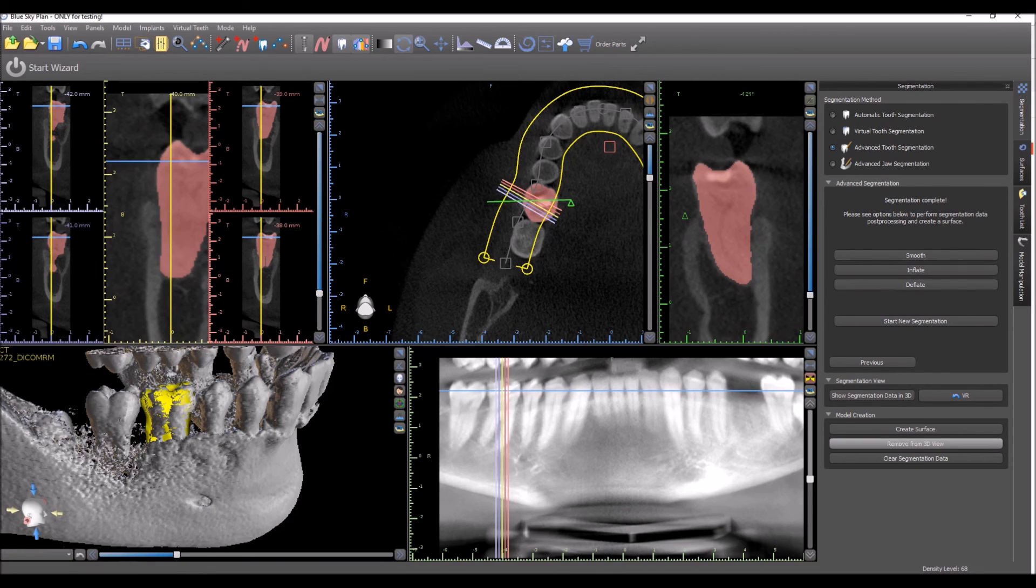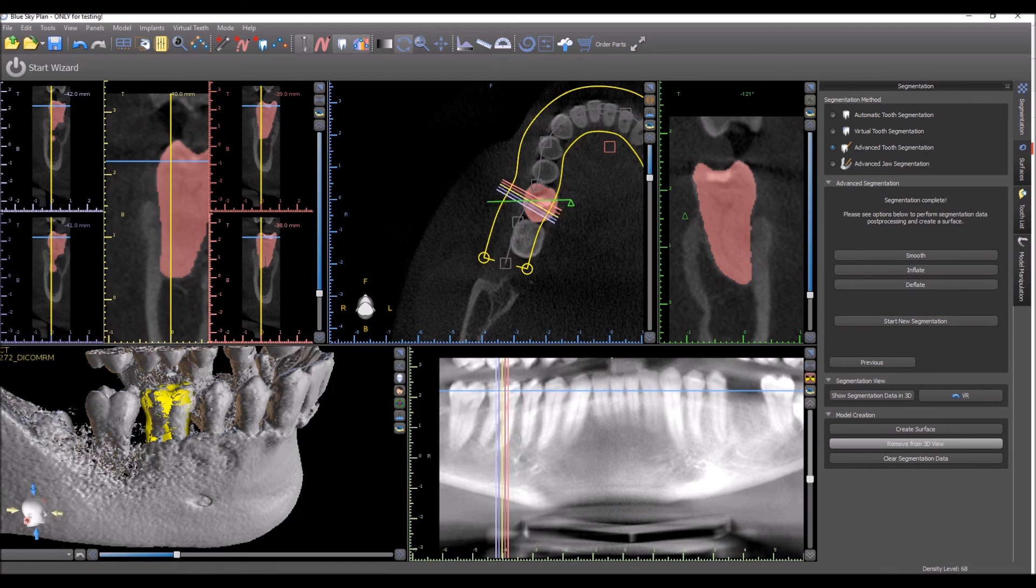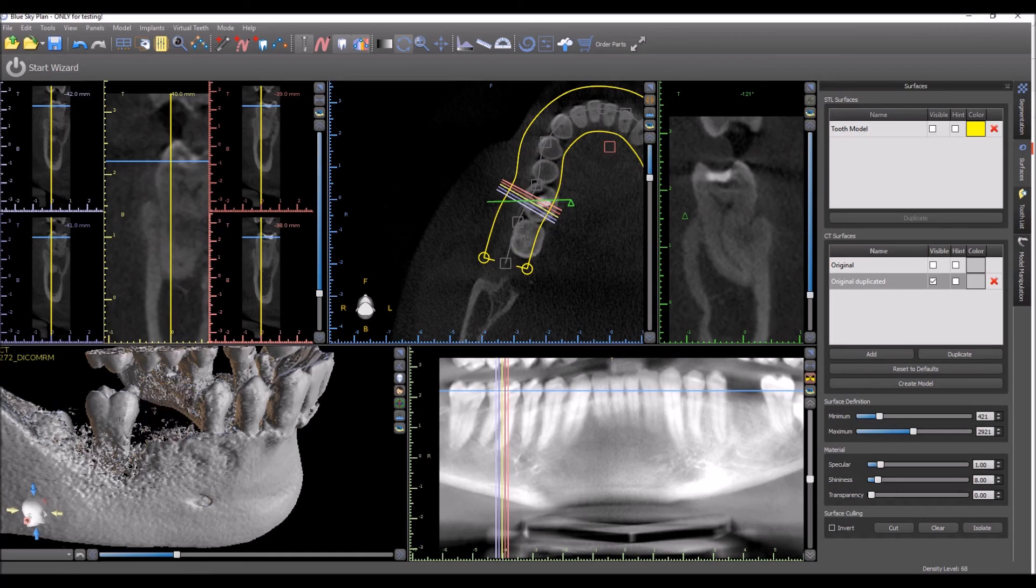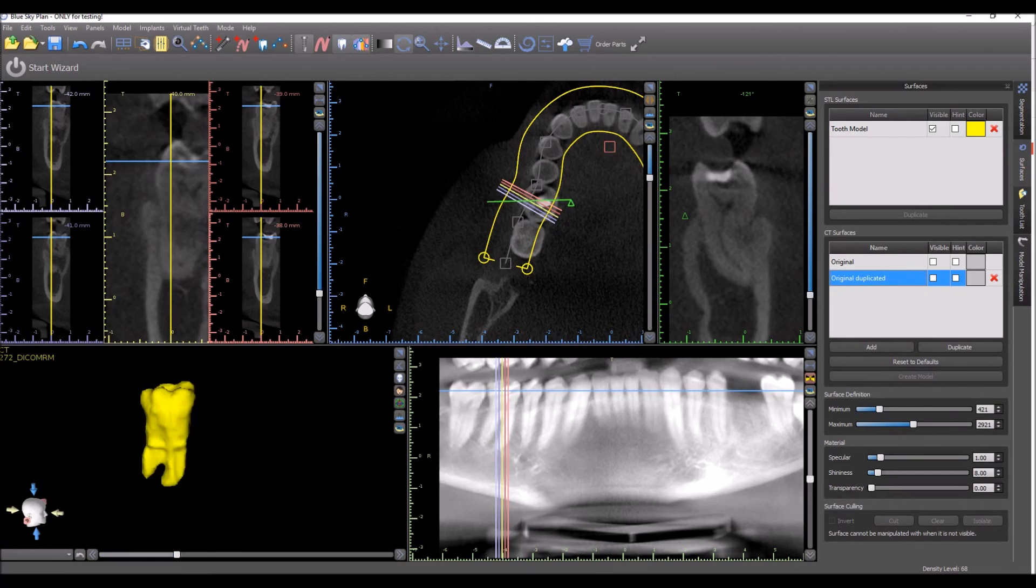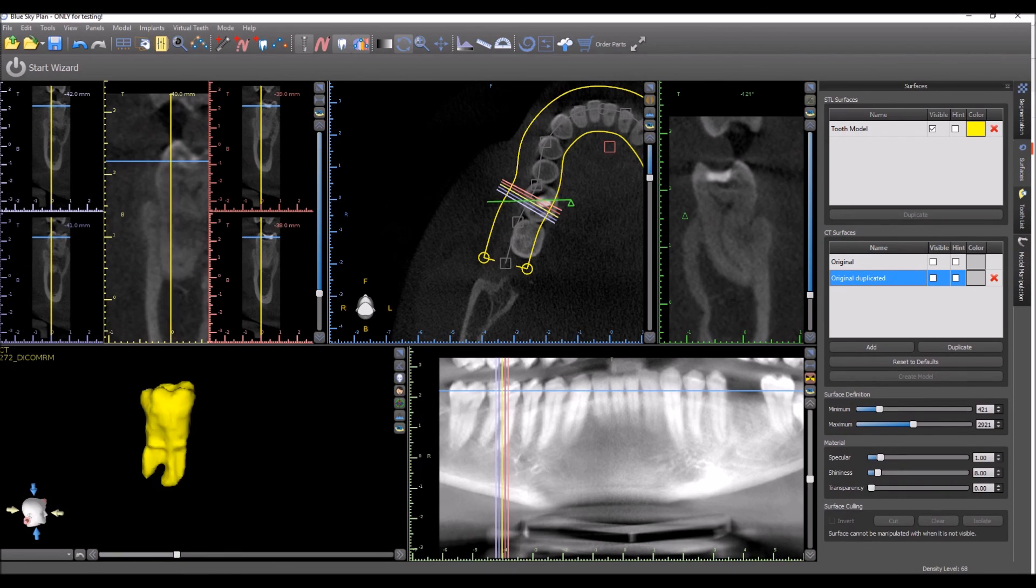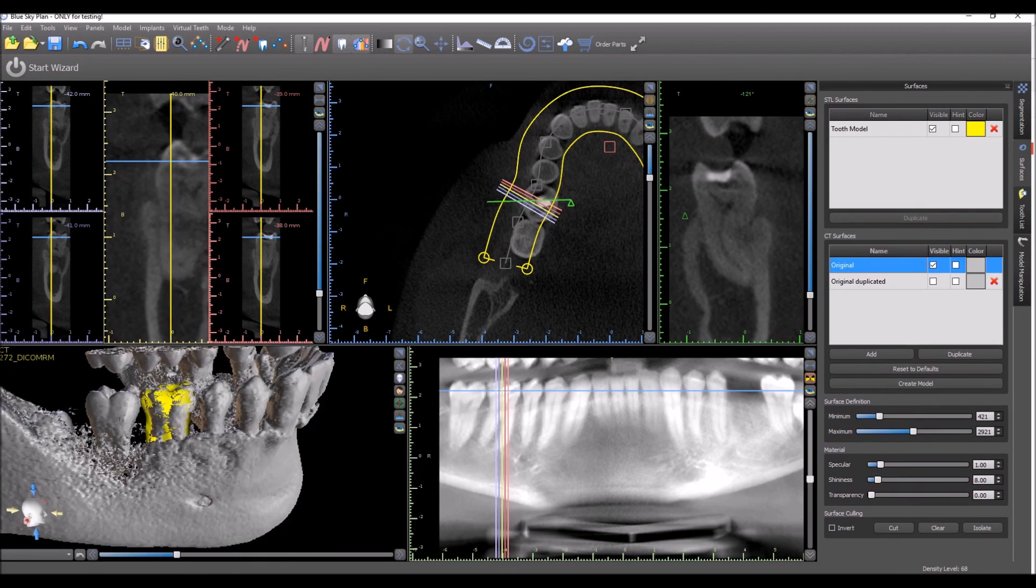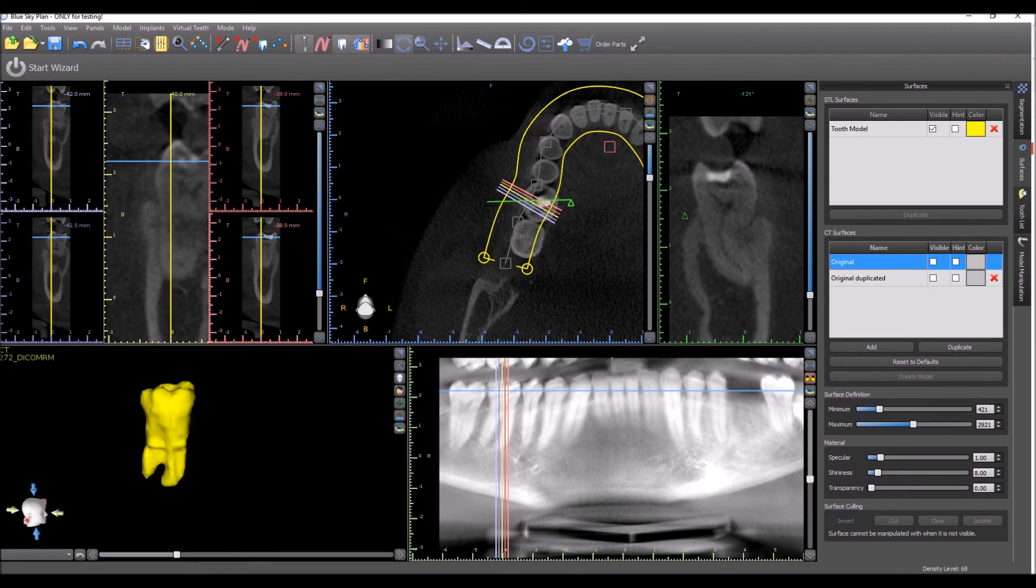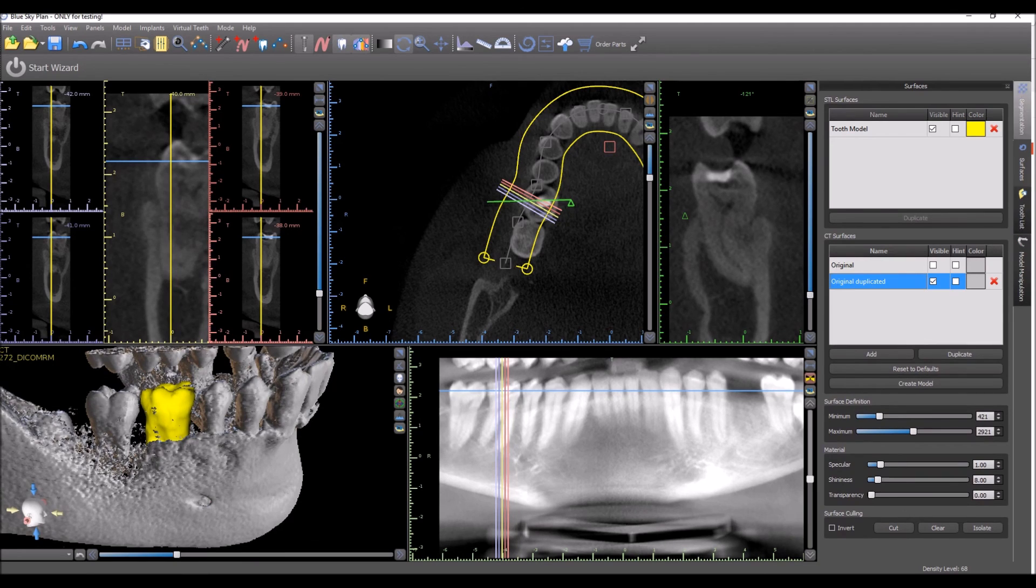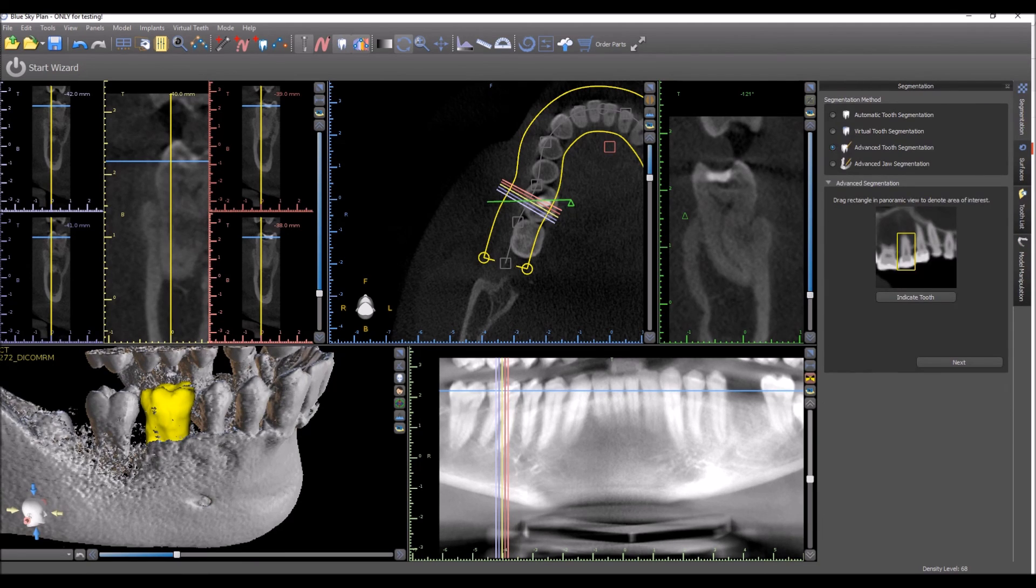And if we want to extract it from the CT scan, we click Remove from 3D view. We now have in our Surfaces panel the tooth model itself. We have the CT with the tooth extracted. If we want to go back to the original CT, we still have the original. And we could go ahead and perform this process on additional teeth.